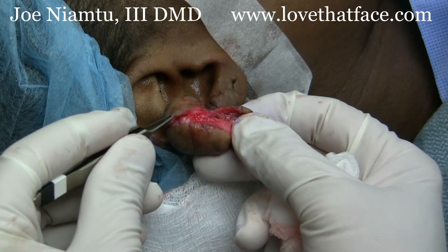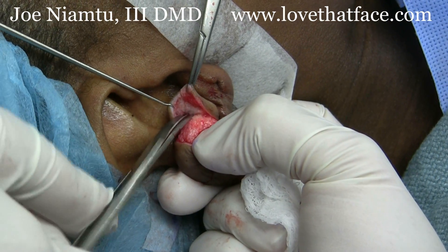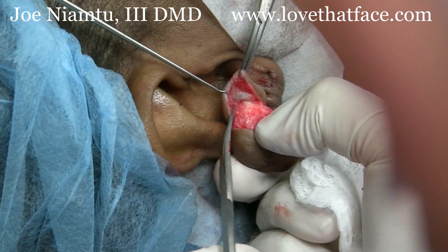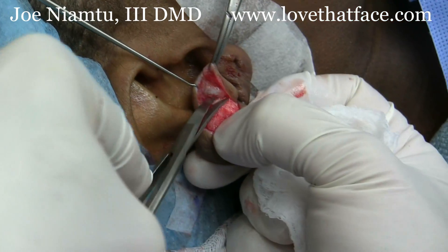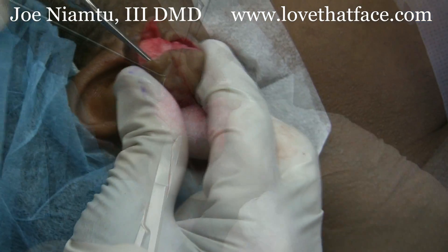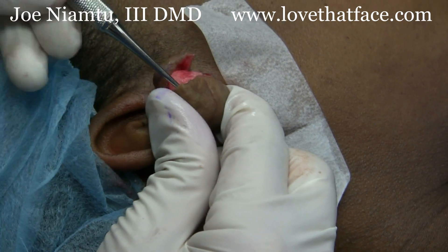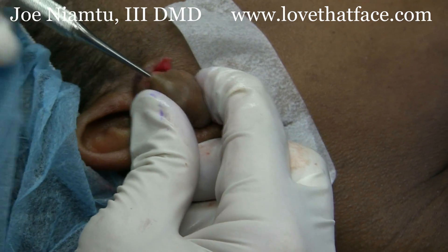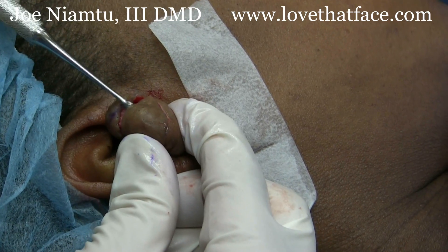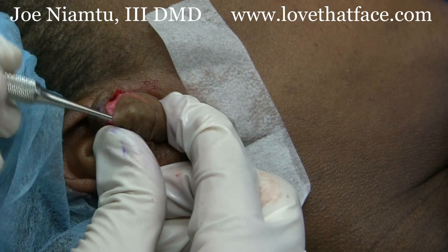We're shelling this out just like if we were taking the skin off of a grape, and this will allow us to get this keloid out in one mass instead of having to worry about all the little bits and pieces. We're using a curette to shell this out. We want to get the skin off the keloid — the advantage is this leaves very little keloid to deal with — and then we're going to take our deep FX laser and go back and treat this.